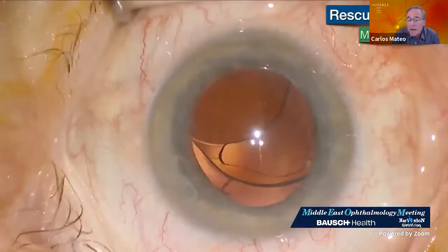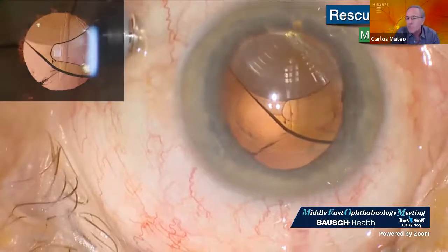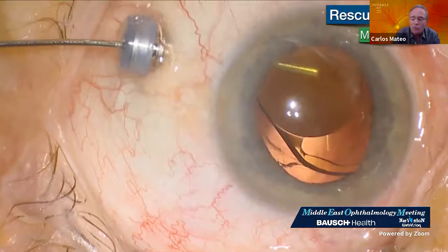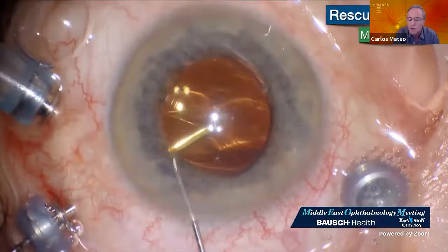Even a multifocal IOL: one week ago I was discussing this topic with anterior segment surgeons, who were already familiar with multifocal IOLs. Even these lenses, with very bad capsular support, you can suture to the back, to the posterior surface of the iris, using 2 sutures.